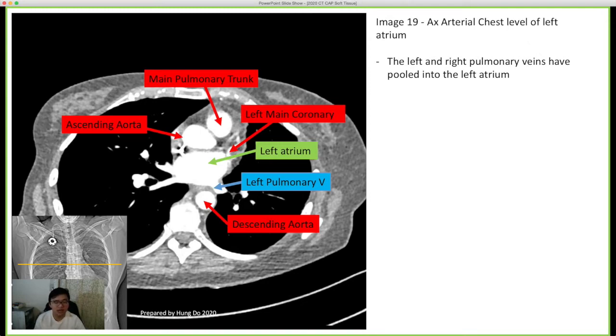Make sure you check the compatibility of the port, and if you're in doubt, do not use the port. And patients will try to tell you that it is a power port, it is compatible with CT. Don't believe them unless you see proof, please.